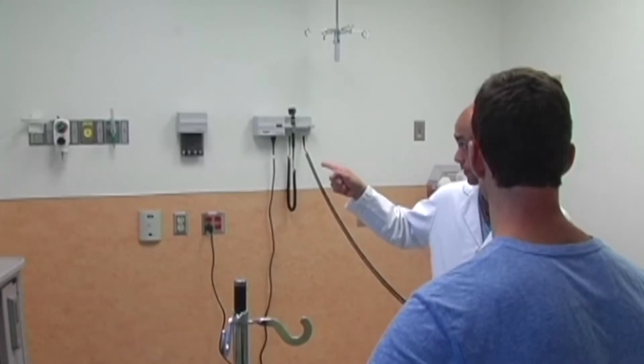Remove yours and the patient's glasses. Seat the patient upright, or with the patient's stretcher set as upright as possible. Position yourself in a direct line of vision to the patient's eyes, and instruct the patient to focus on a fixed object at least ten feet away.